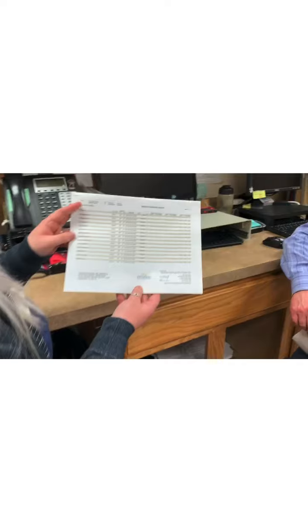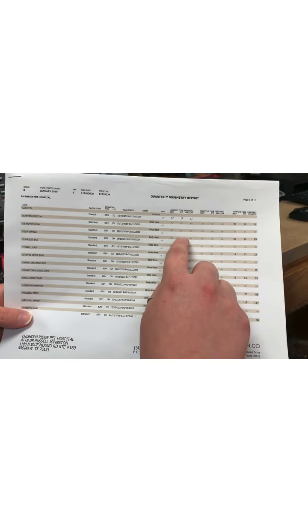Can you show me the dosimetry readings of one of the team members? Yes. So here we have our Patterson radiology report. My name is here, and right here it says the current dose of the deep, which means the deep tissue, and it says ND, which means non-detected. Then we have the eye, which is showing ND as well. Shallow, which means the skin, is non-detected for our current dose.